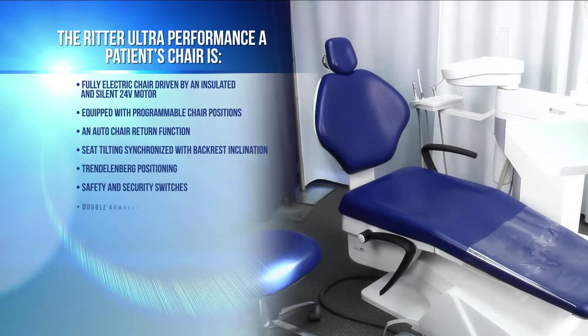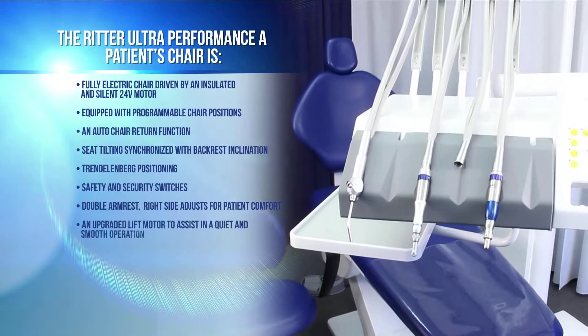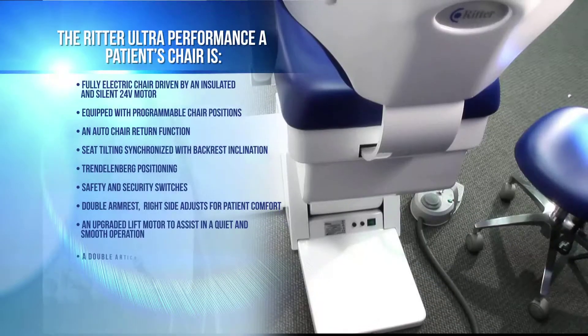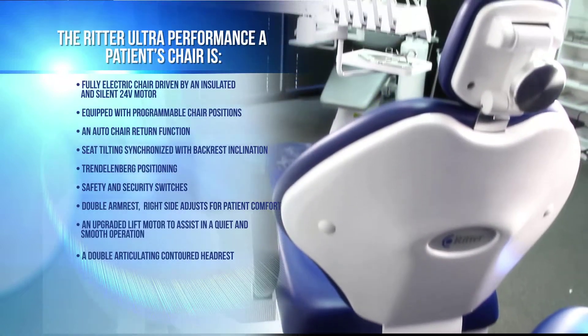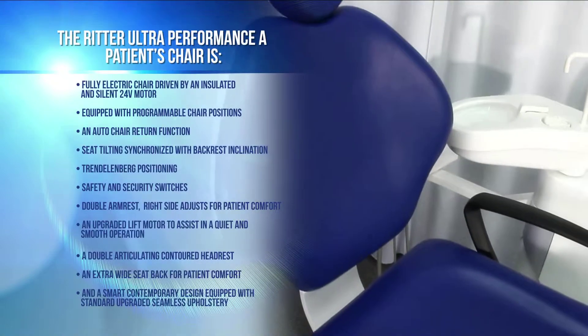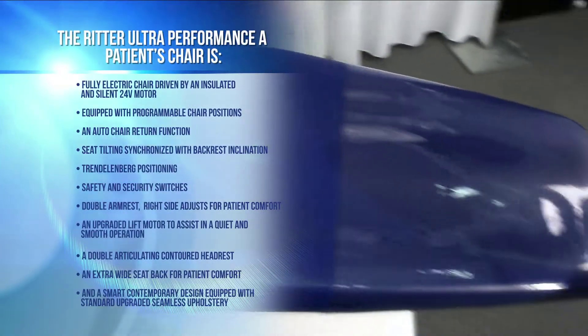The chair also features safety and security switches, a double armrest with right-side adjust for patient comfort, an upgraded lift motor for quiet and smooth operation, a double articulating contoured headrest, an extra-wide seat back for patient comfort, and a smart contemporary design equipped with standard upgraded seamless upholstery.